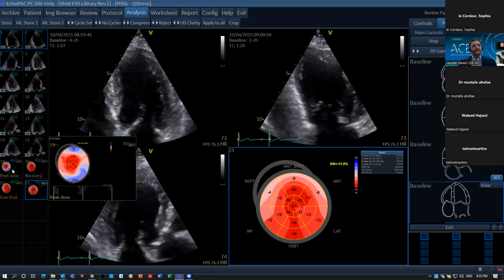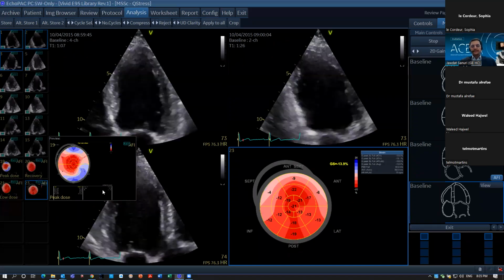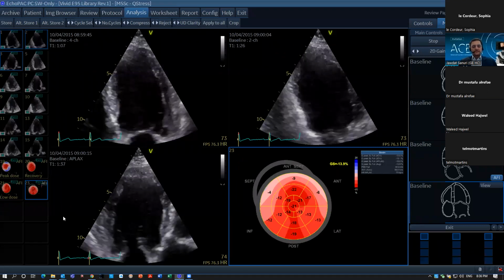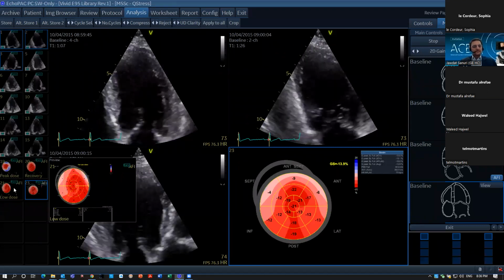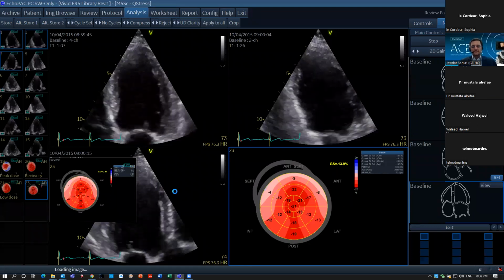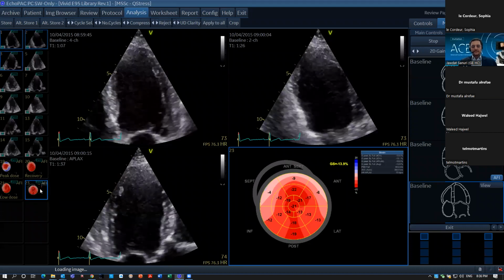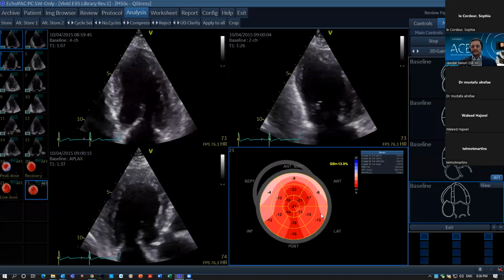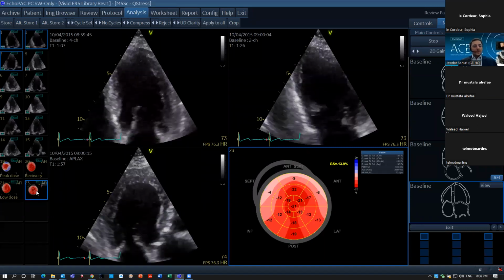I don't know, how can we depend on this? Can we compare the rest stage AFI with the peak? Especially since we have different loading conditions. For example, the patient's blood pressure might be 200 at peak. You have low strain or low GLS during peak. So how can you compare rest with the peak with different blood pressure?